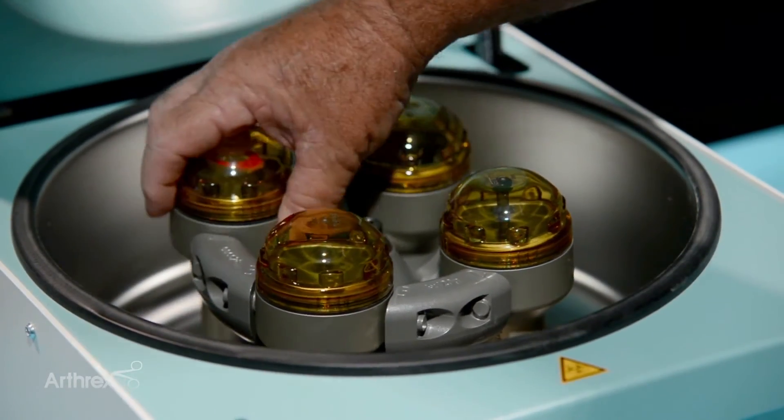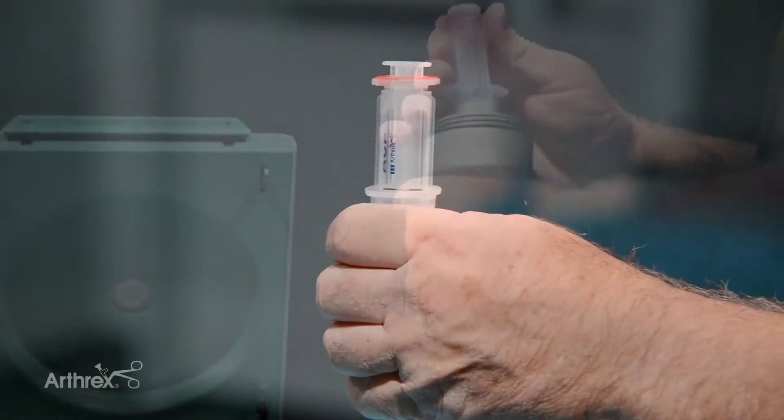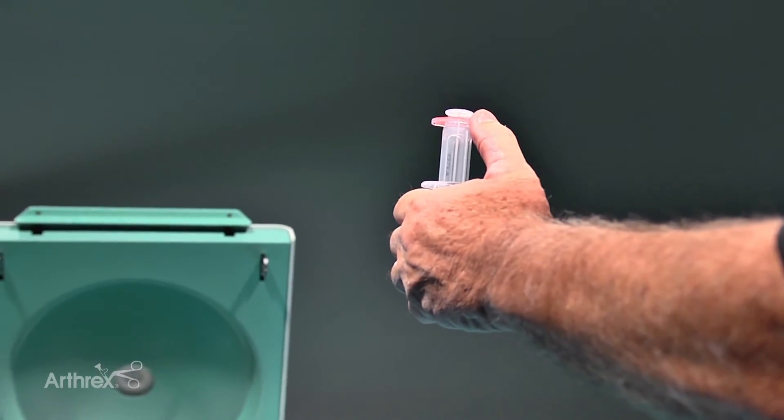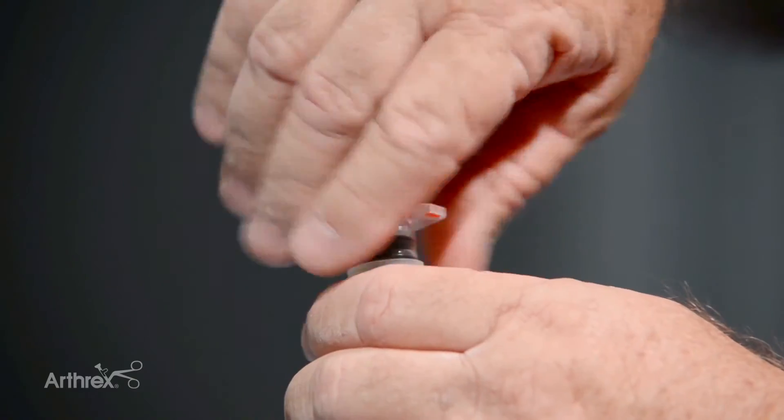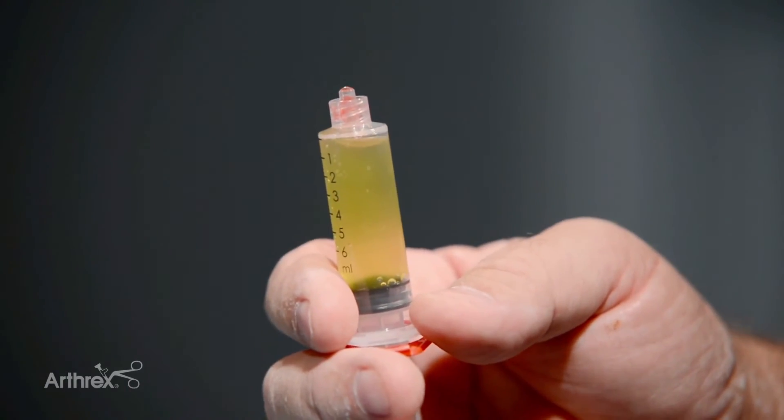After centrifugation, go ahead and get your product. We're going to push down on the red and pull up on the inner tube, then unscrew it and use it at the point of care — or you can freeze it for up to six months.